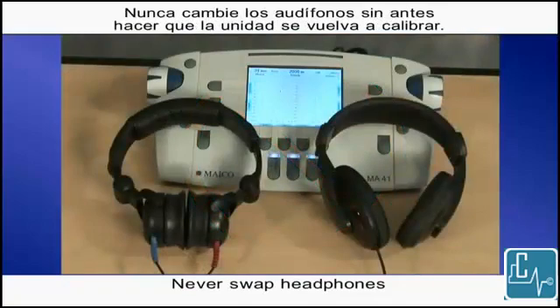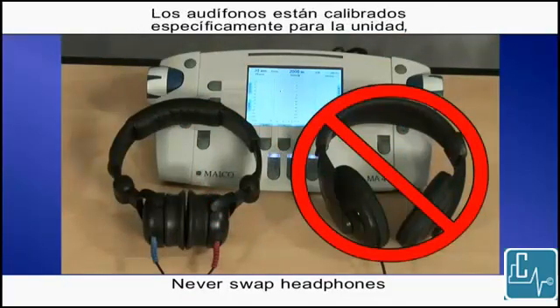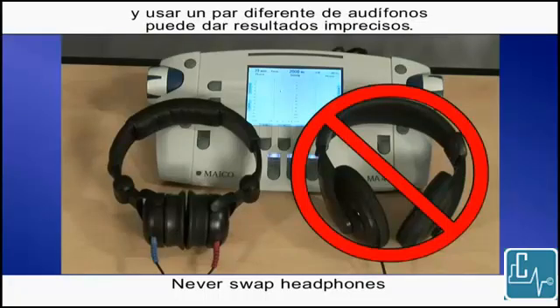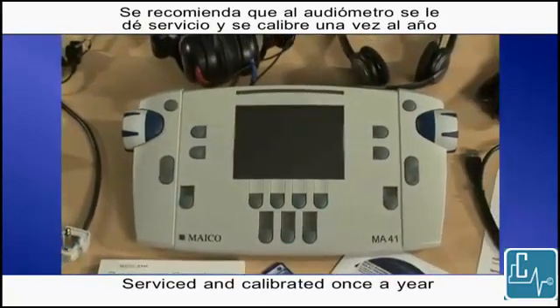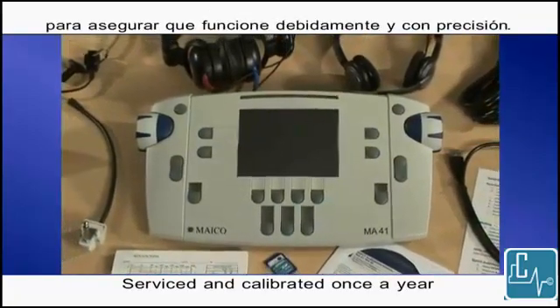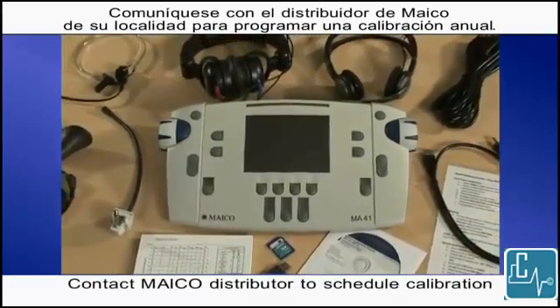Never swap headphones without having the unit recalibrated. The headset is specifically calibrated to the unit, and using a different pair of headphones may give inaccurate results. It is recommended that the audiometer be serviced and calibrated once a year to ensure proper function and accuracy. Contact your local Mako distributor to schedule an annual calibration.